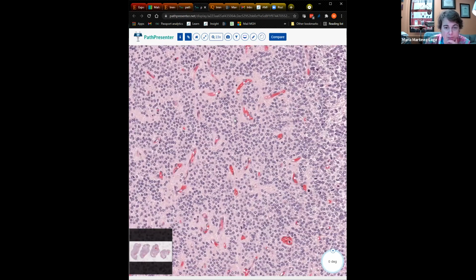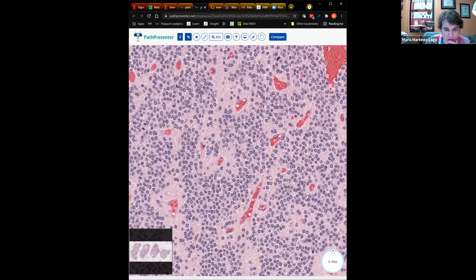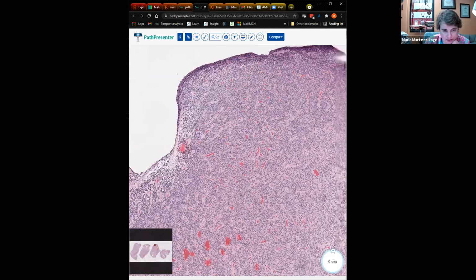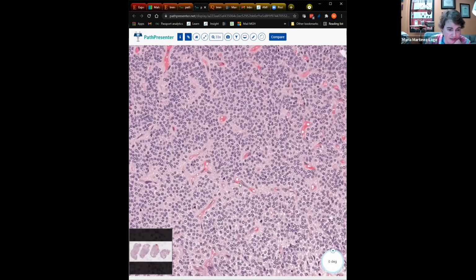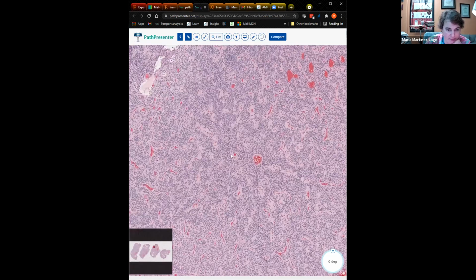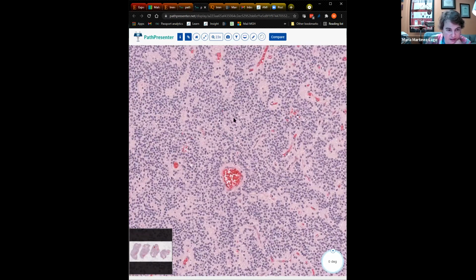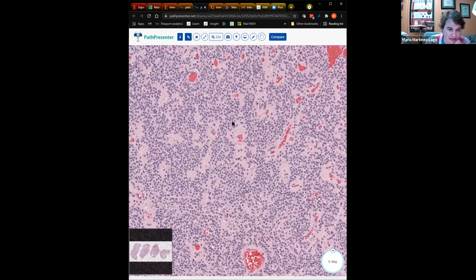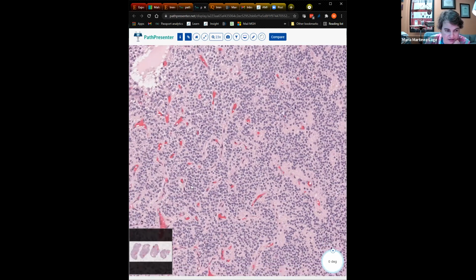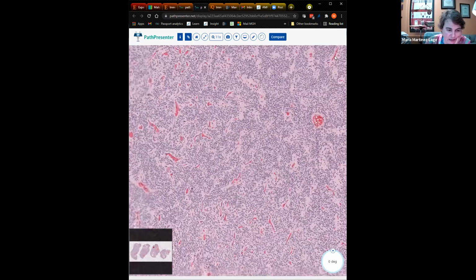So there's a number of things that this might remind you of, right? With these really round looking nuclei, proliferation of cells in the background of neuropil, it might make you consider oligodendroglioma, for example. And in some cases, they can be mimickers of oligodendroglioma. There is this arrangement around vessels, so that on low power might make you think of ependymoma. But you can see that the distinction is that these perivascular pseudorosettes are a little bit less defined than in ependymoma. Nuclei are interspersed in all areas of these perivascular spaces. They're not as clean acellular areas, as you can see in ependymoma.